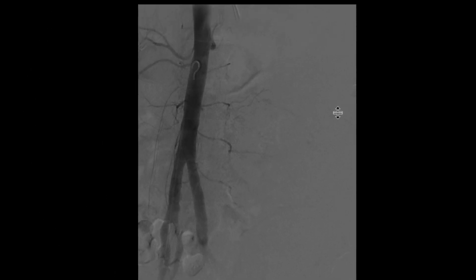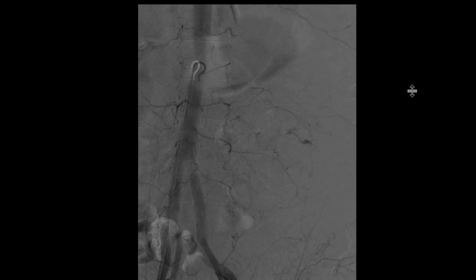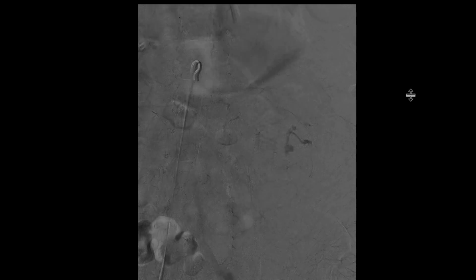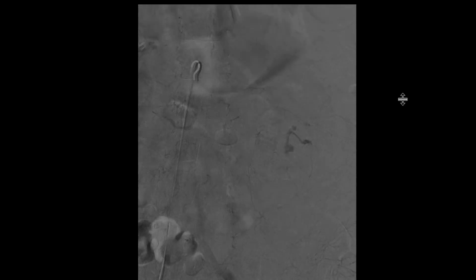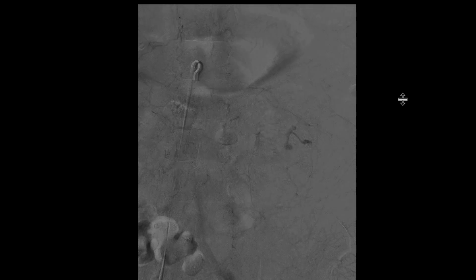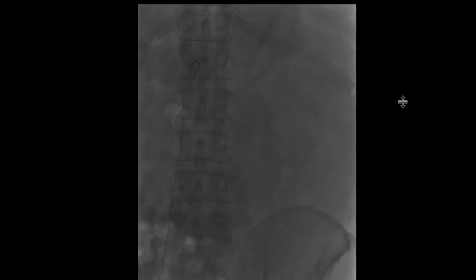This was part of the study that they performed — we can see the angiogram. When they injected contrast, you can see immediately there's active extravasation of contrast from these distal branches arising from the lumbar arteries at L2 and L3. That was the source of the bleed. The patient subsequently got embolized and the active extravasation was treated.